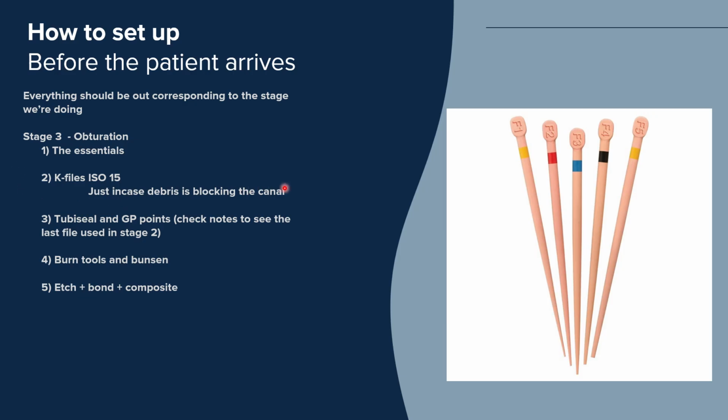Just to check to make sure there's no debris blocking the canals. And then you also need a sealer. Tubliseal is one that we use. At the moment, I'm using one called EndoSequence Ceramic Sealer, which is what a lot of specialists like to use, and I like to use it as well.